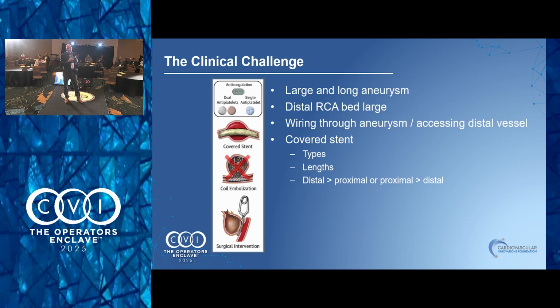Yeah, but you have to stack them, and pray you don't lose one wire after another. Because if you lose your wire position, you're gonna be really screwed.